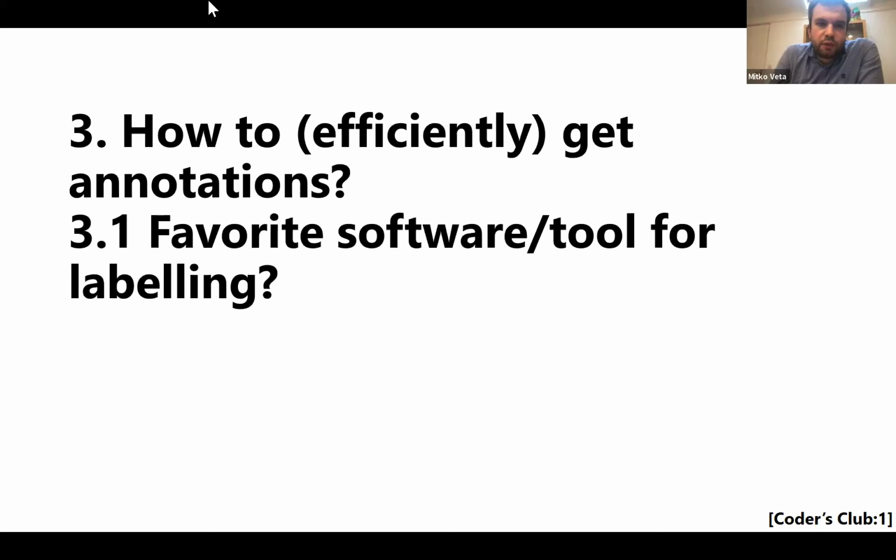Or something in between is if you can train somebody that's cheap to do it in one day, then that's also a nice option. That's something we often do with master students. A pathologist can train them for a few hours and then they can do the task, which can then be fixed by a pathologist. So we try to have the students become competent to at least develop their own annotations, I'll say with 85%, 90% competency, so that they can do a lot of that bulk work and then send it to a pathologist for final review, where a pathologist can say, yeah, I agree with this.